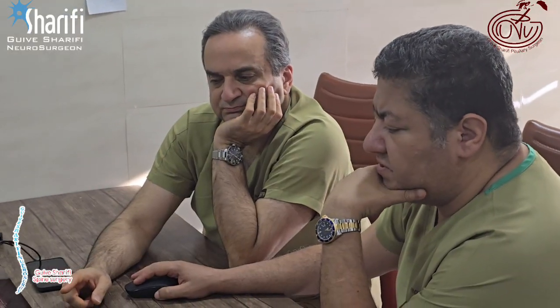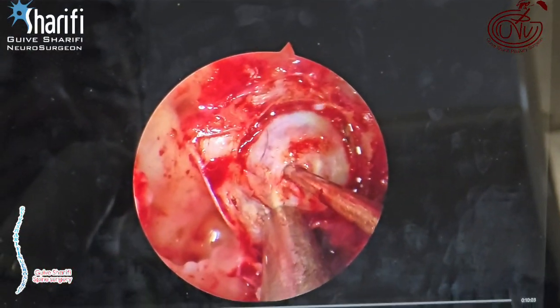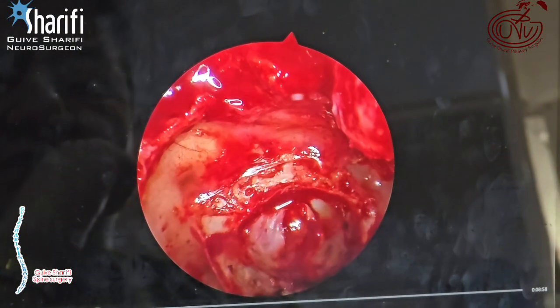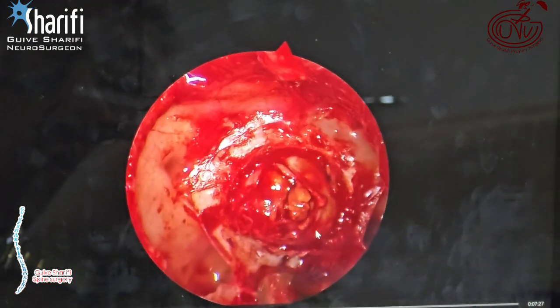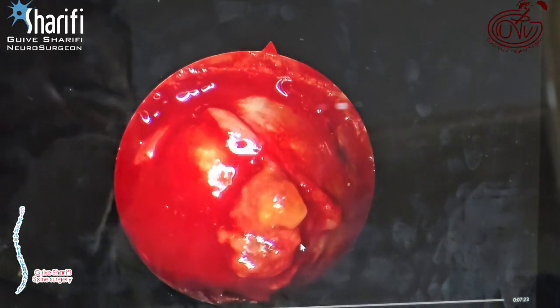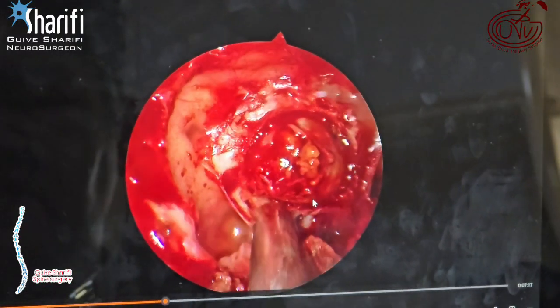Dr. Akbari, our ENT colleague, exposed the whole sphenoid, and we are inside. I opened the dura, and on opening the dura, this yellowish material came out. This yellowish material, like a fibrinoid change, is seen in some adenomas also, adenomas that had bleeding inside them.